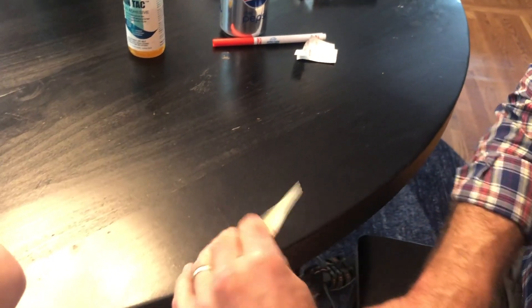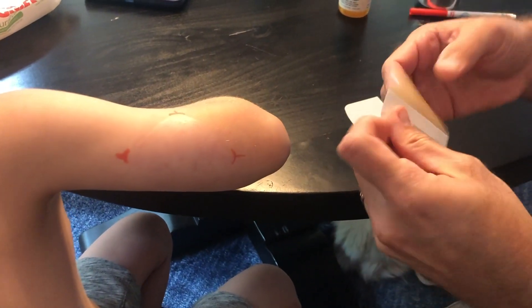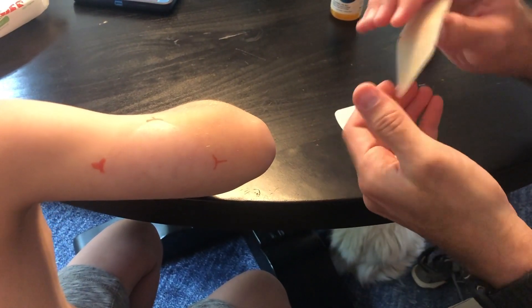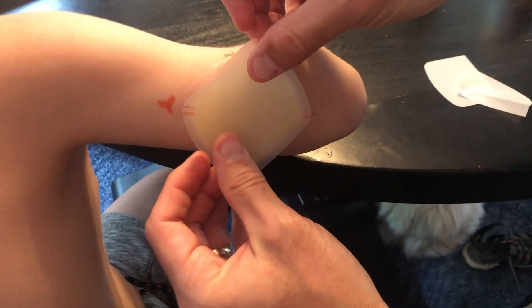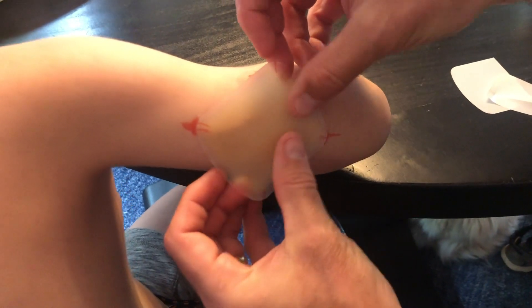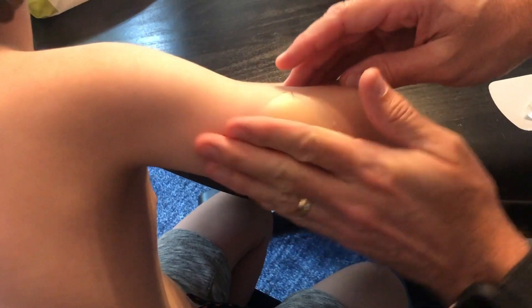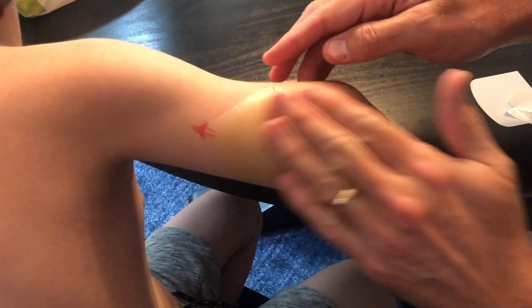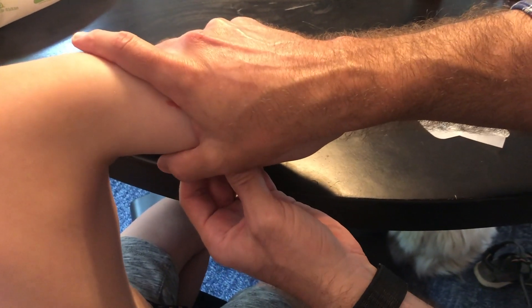Now it's nice and warm and soft. Pull the backing off like so. I put the two marks at this side, so I line up those marks and the marks down here, then lay the rest across like that. Then I just hold this down flat to the arm for one minute.